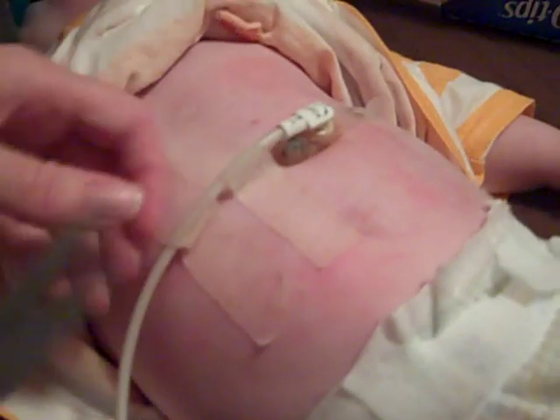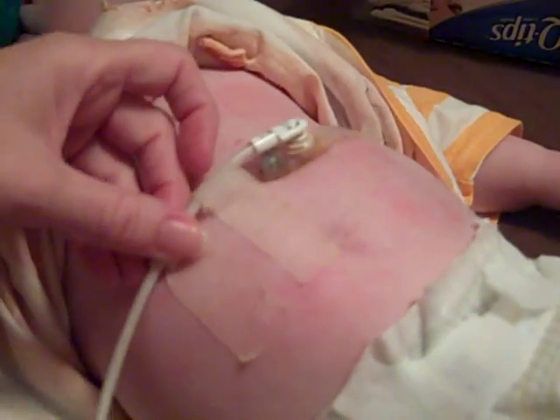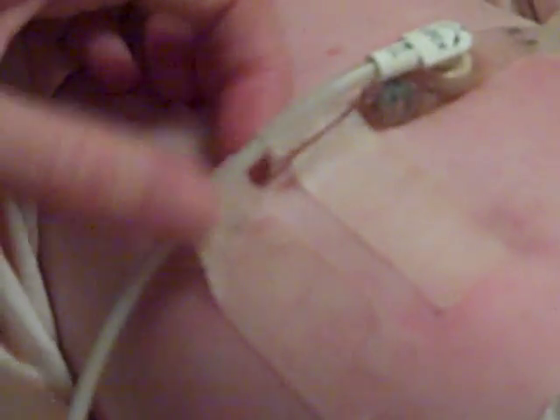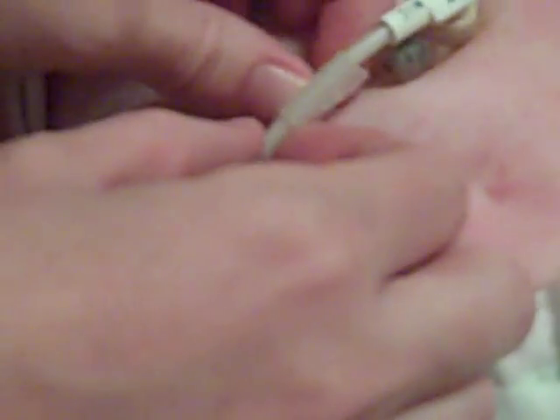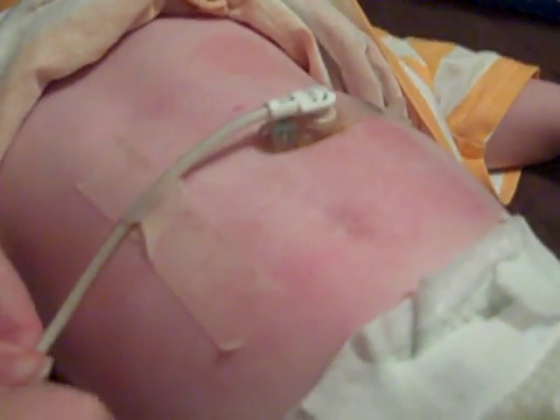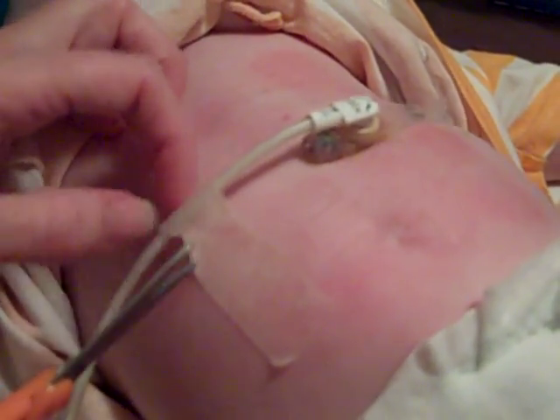And he's hooked up to this 24 hours a day. So usually you're able to twist it off, but sometimes because it's gotten so hard, you're not able to actually twist it off. You have to cut it off, which if I cut it, that means it's going to ruin it. If I can twist it off and it's still pretty flexible, then I can reuse the tube. But in this case, this tube is pretty tough. So I'll try to twist it, and if it doesn't work, then I will just cut it off.